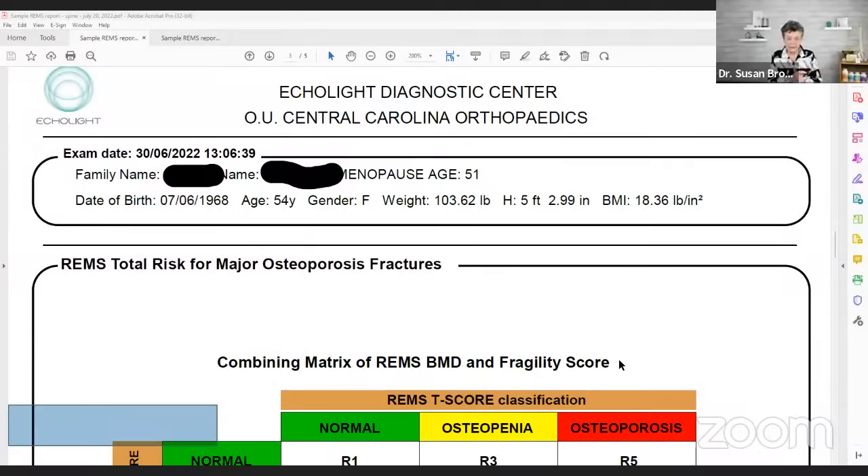Let's show what this report looks like. We're going to put up a visual of what the Ecolite report looks like. The Ecolite is done on both the spine and the hip, which is really helpful because hip fractures are of course the very expensive and often life-threatening fractures. This ultrasound technology can measure both the spine and the hip.